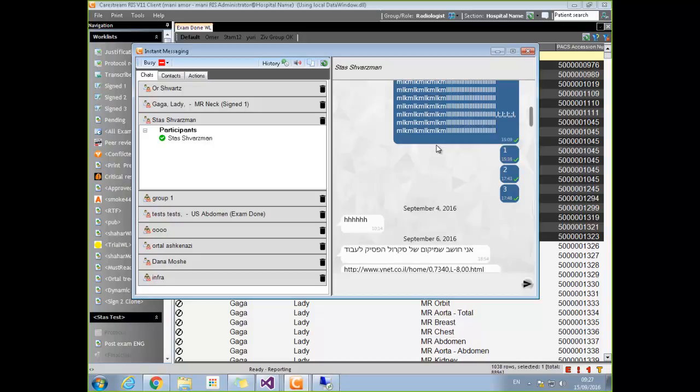When we thought about moving files, we have this technology in the central manager. Central manager and instant manager underneath are using the same technology. It's not an easy technology. In a web server, you usually trigger a request from client to server, and if you need to chat, you need full duplex.